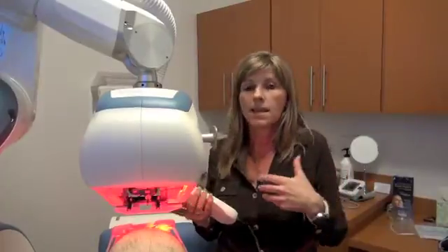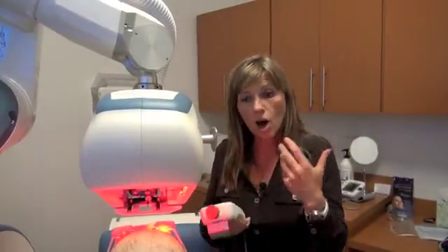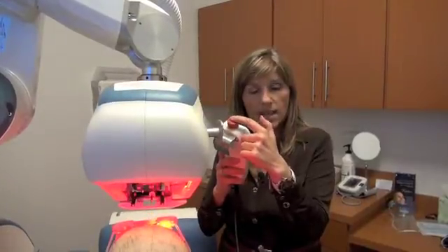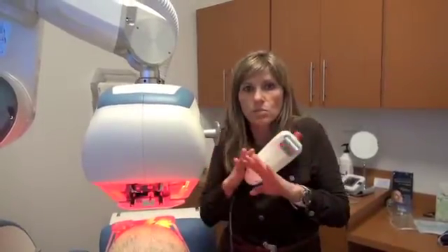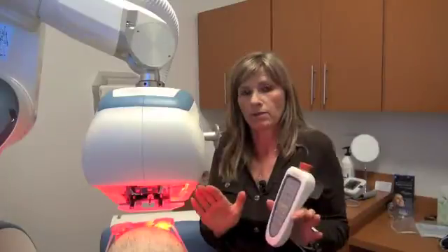Also, if the procedure is going on and the physician judges that the patient is moving and everything should be stopped, there's an option called the e-stop button. We can press this and the system retracts the instruments, stops everything, and we can address the situation. So it's very easy to stop everything.